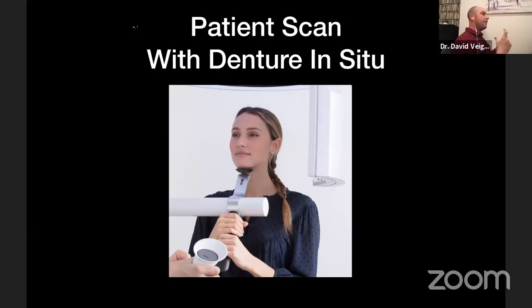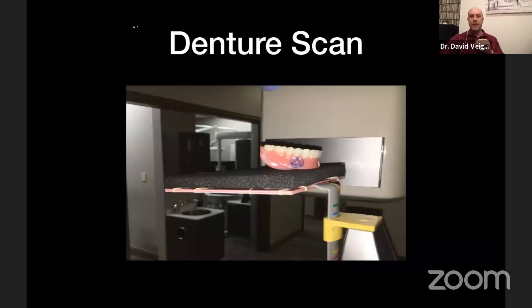And if they're fully edentulous, what I like to do is get them into the rest and then get them to bite together in occlusion. And that is my very first scan. Right when I've taken that scan, so the patient's in the scanner with the radiographic markers in, with their denture in situ, I immediately take the denture out, and then I put the denture back into the scanner. And then I scan the denture as well. And what that's going to create is 2 different DICOM data sets: patient scanner with the denture in, and the denture only, okay?